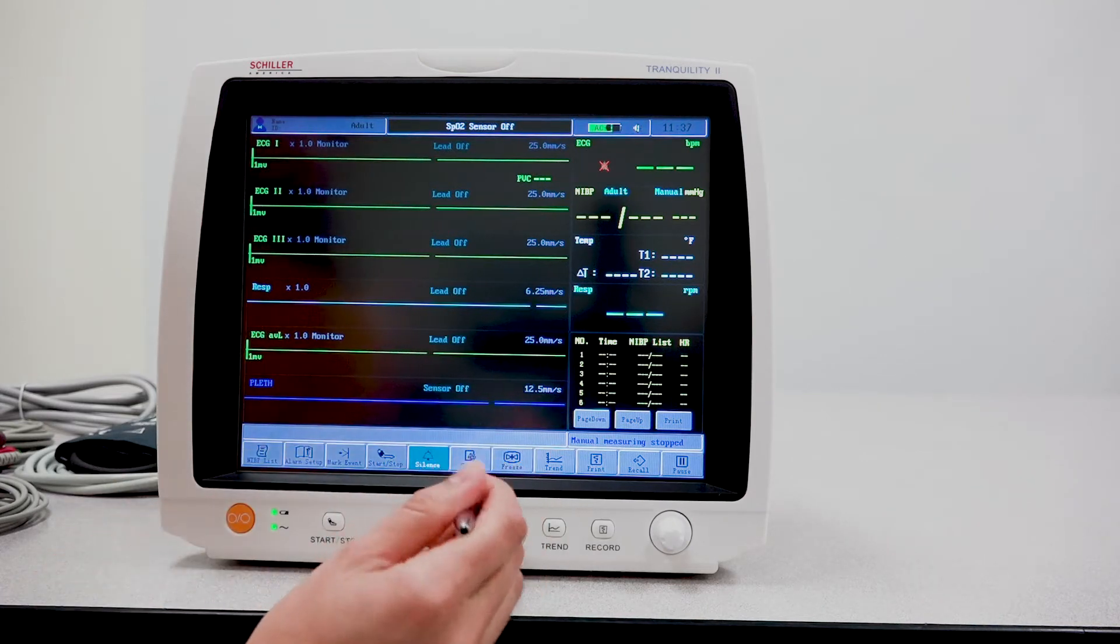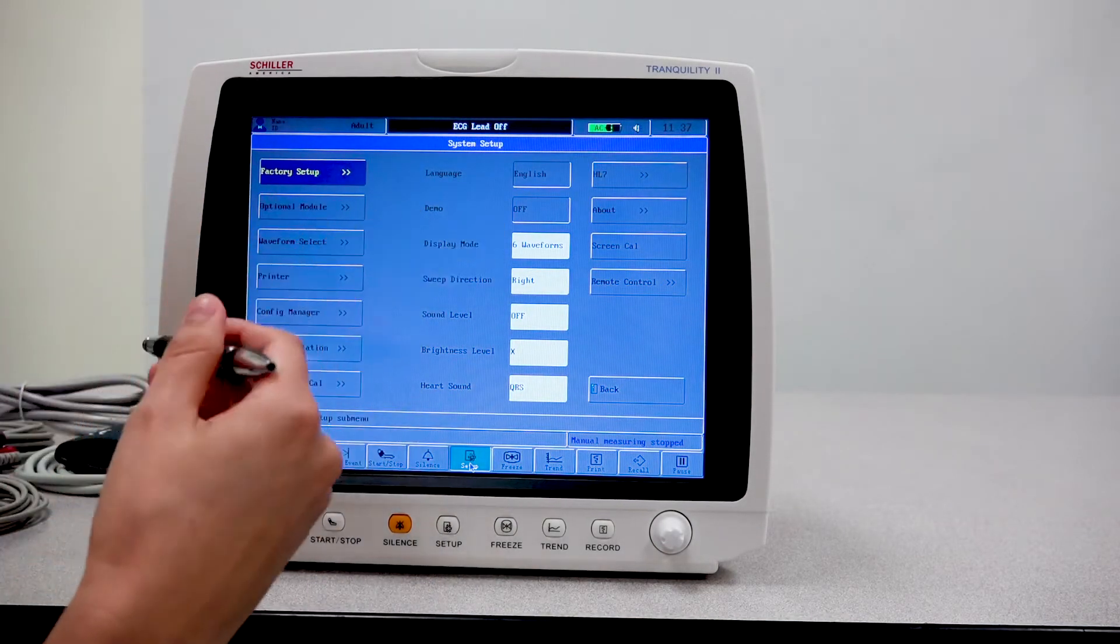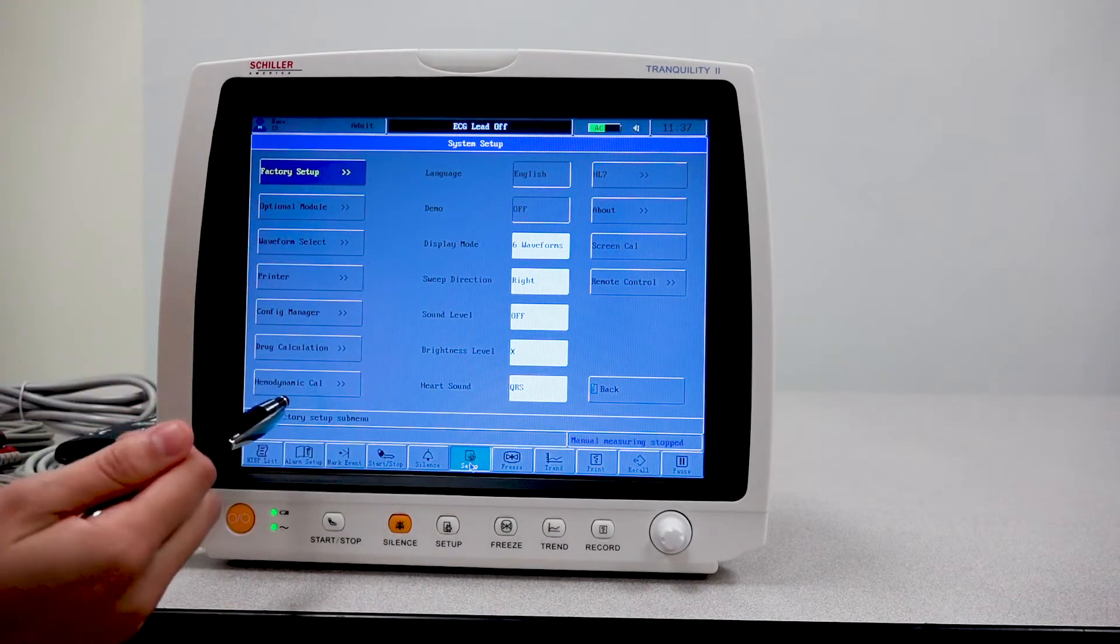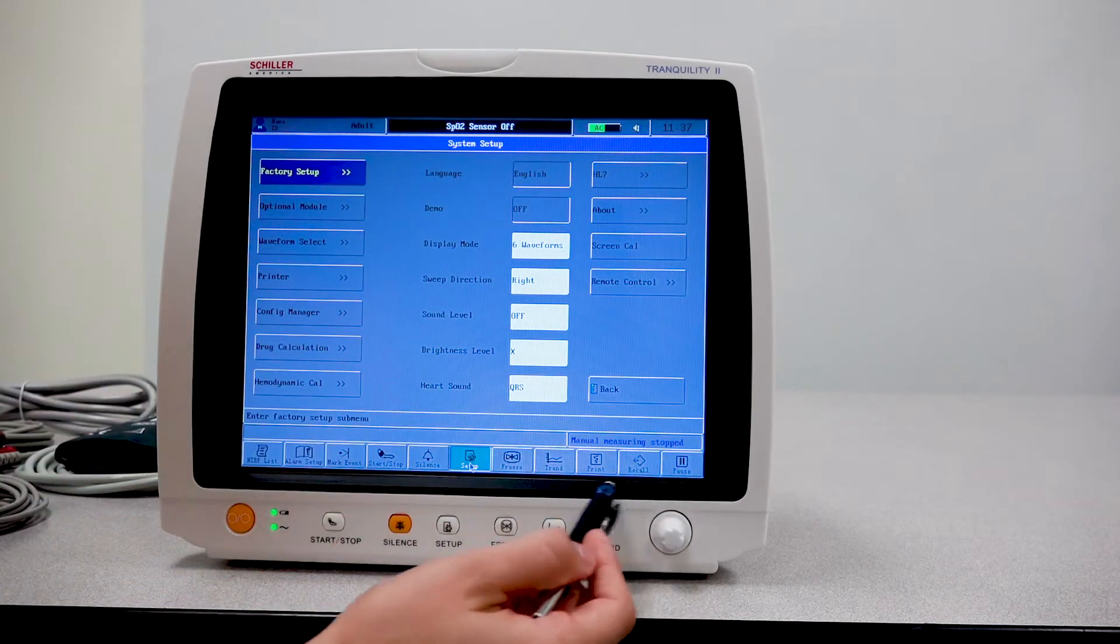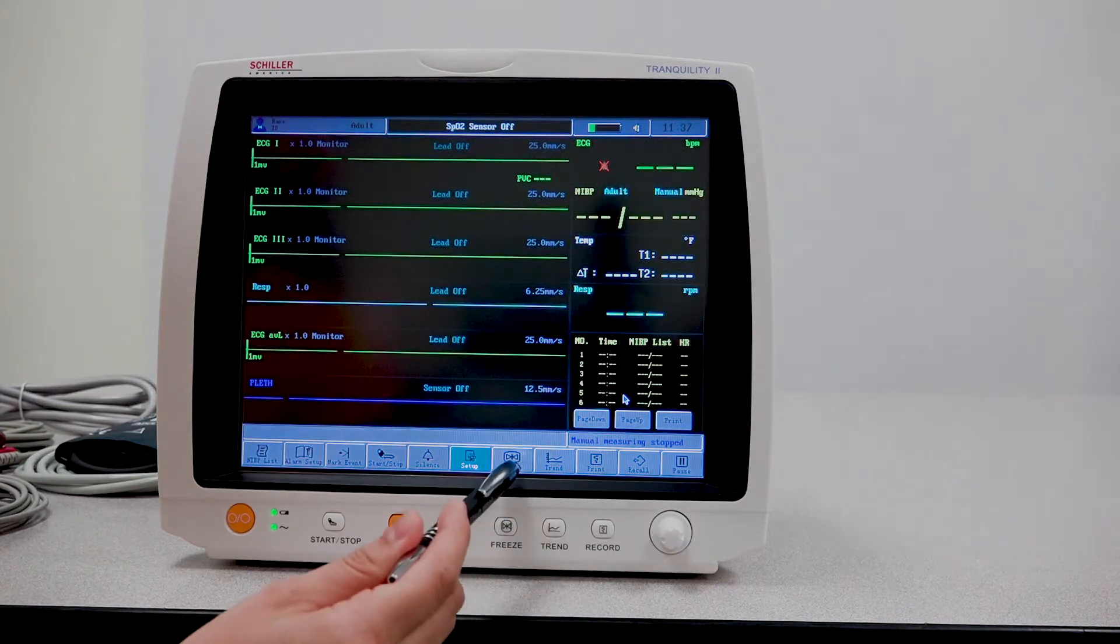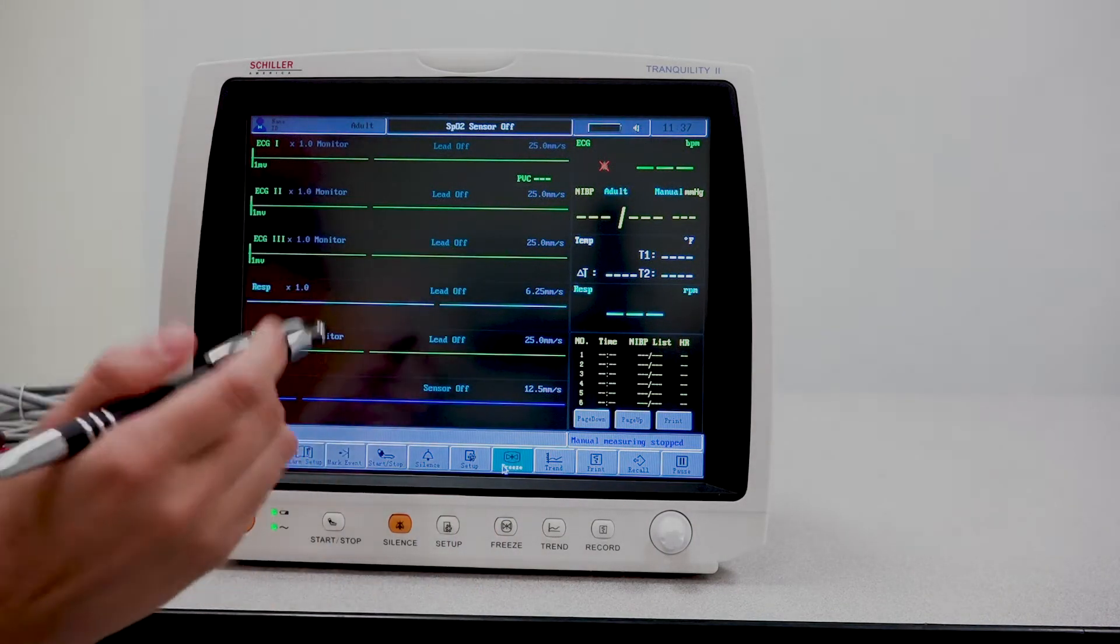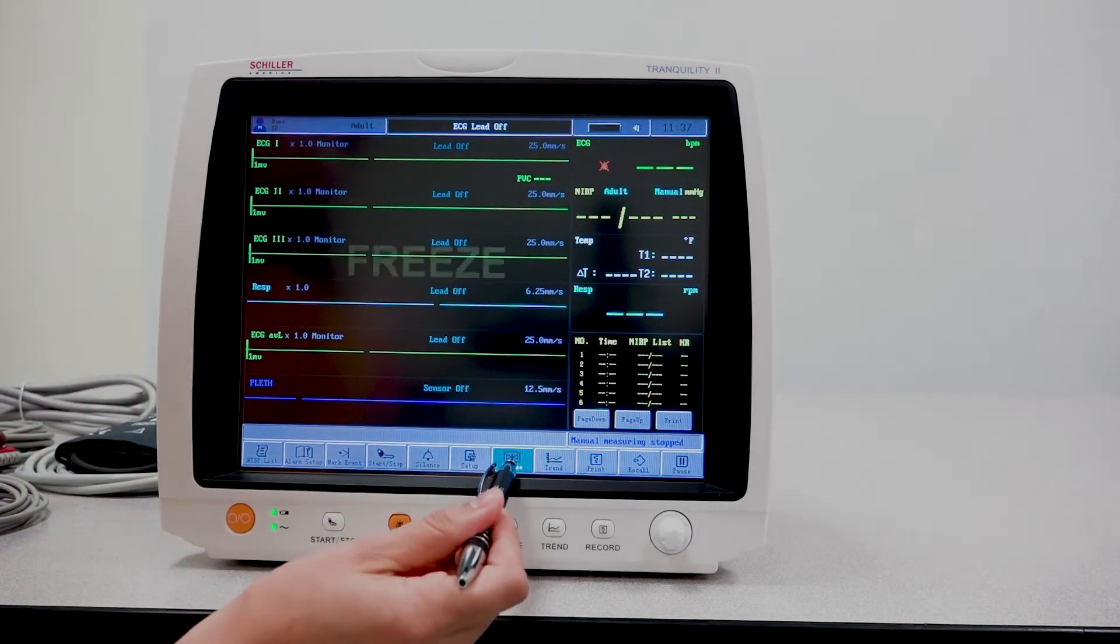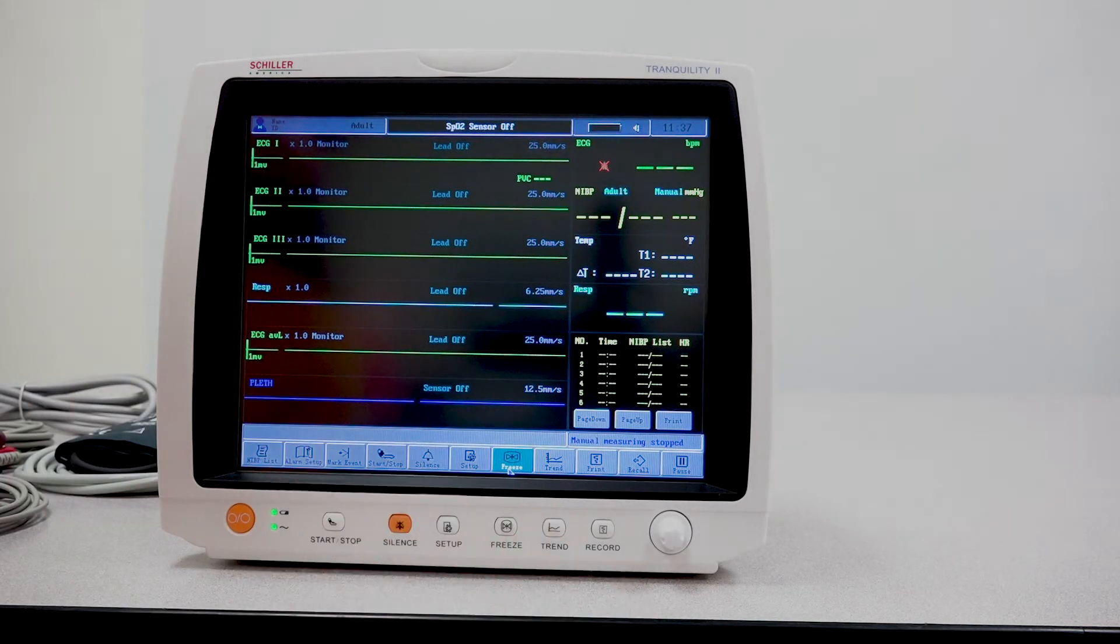Now in setup here, you have all the options to set your unit to whatever settings you choose to. There are quite a lot of options here. You also have your freeze button. This will freeze the screen if the doctor or the nurse wants to. You tap it once more to unfreeze and go back as usual.